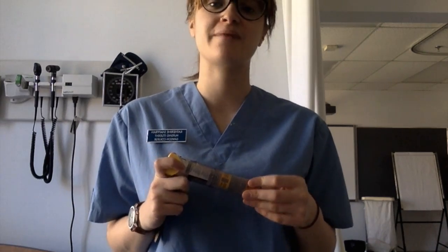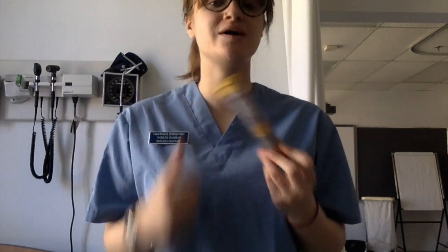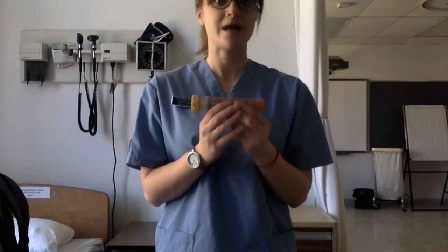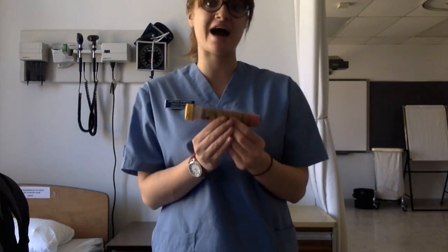Hello, my name is Katherine Shaffran and I'm a student nurse here at Dawson College. Today I'm here to show you how to administer an EpiPen — specifically on yourself or someone who is having an anaphylactic episode.